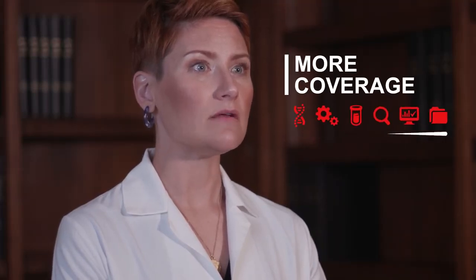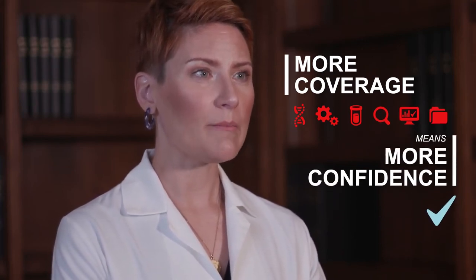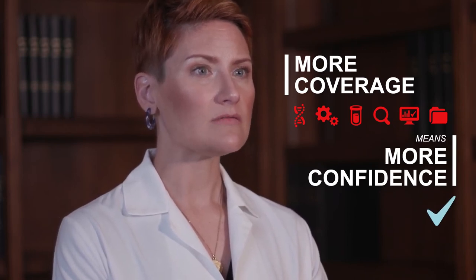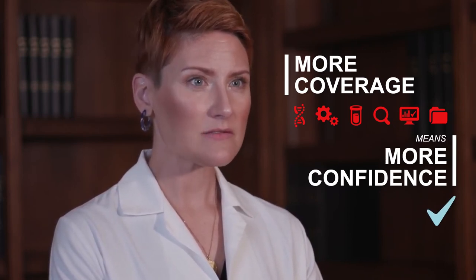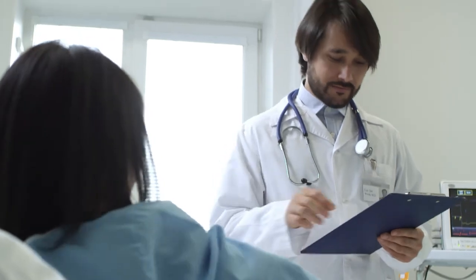I feel like with extended options in single antigen testing, we feel much more confident about the estimations in our immunologic risk assessments. The testing is done before the immunologic risk assessment has to be performed, so that when the time comes that a patient comes up for an offer, we don't have to scramble and do a bunch of additional tests in that moment and potentially delay transplantation because we have accurate data at hand.